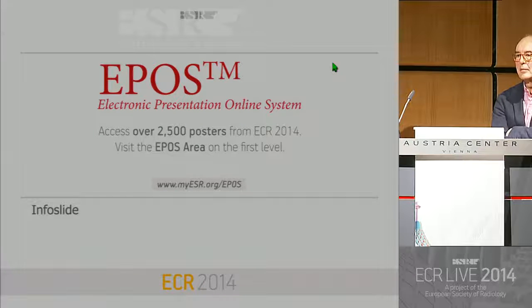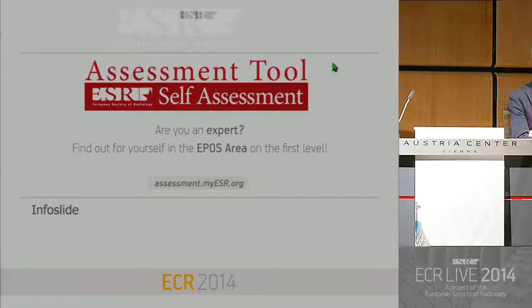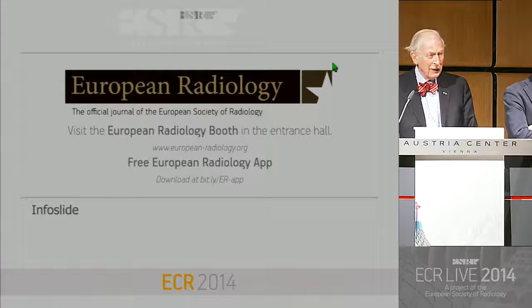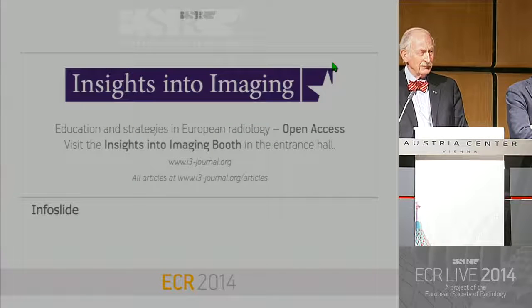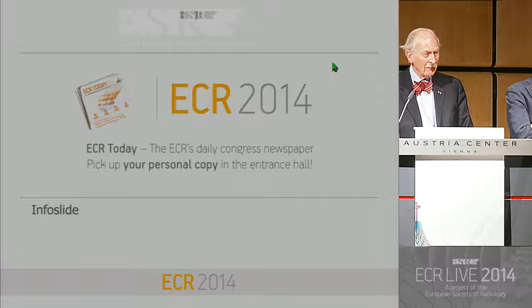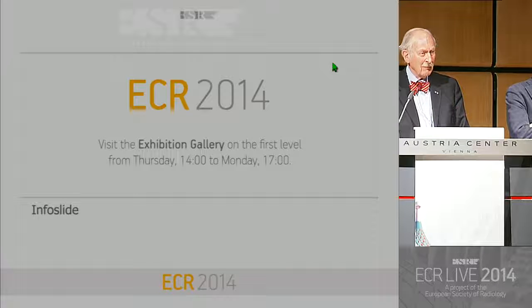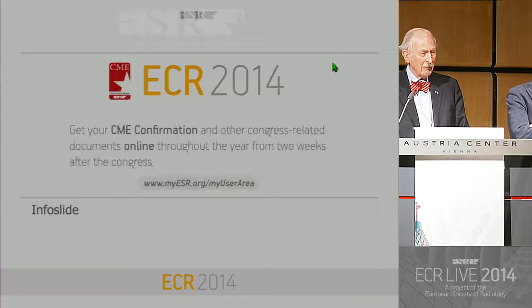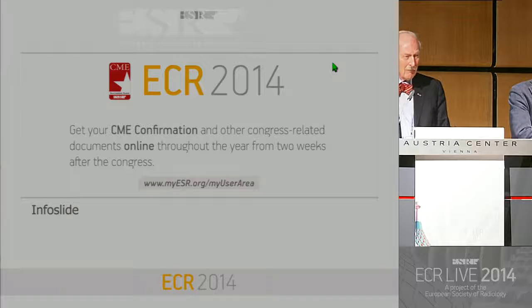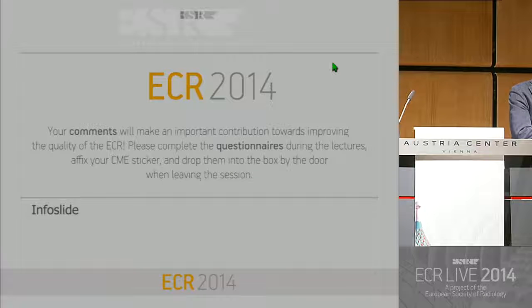Excuse me, I have a question about the contrast enhancement. Does it have any negative predictive value? In other words, you see something in the transition zone on the T2 or on the DWI, and it does not enhance at all. Have you seen a cancer where it would be suspicious on the T2 and on the DWI in the transition zone and does not enhance? We're talking about when it's not enhancing rather than enhancing.